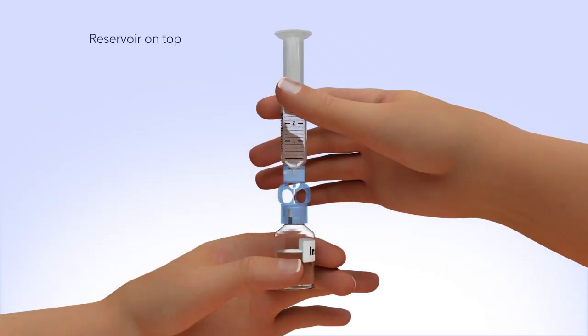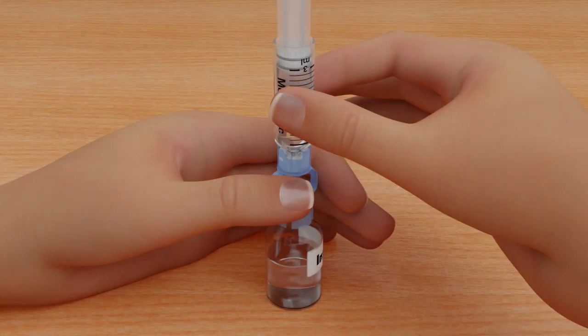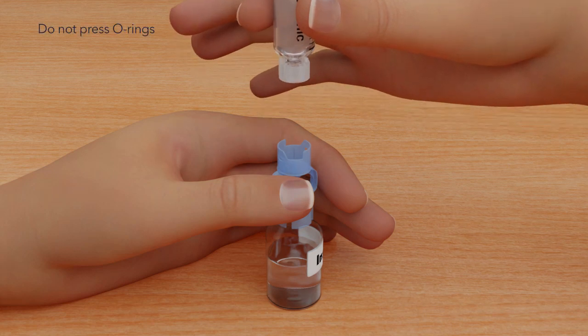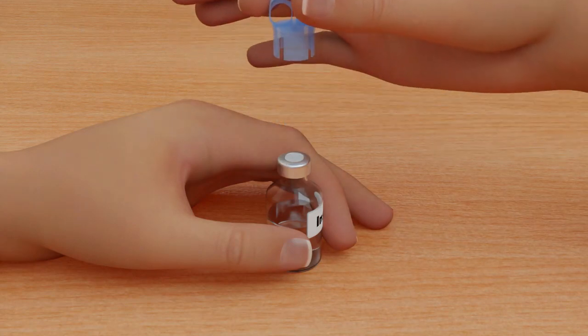To avoid getting liquid on the top of the reservoir, flip the vial over so it is upright. With the vial down on the table, hold the transfer guard with one hand. With your other hand, turn the reservoir counterclockwise and then pull straight up to remove it from the transfer guard. Be careful not to press on the o-rings. Disconnect the transfer guard from the vial and dispose of it properly.